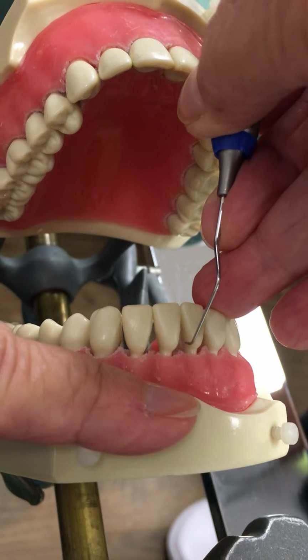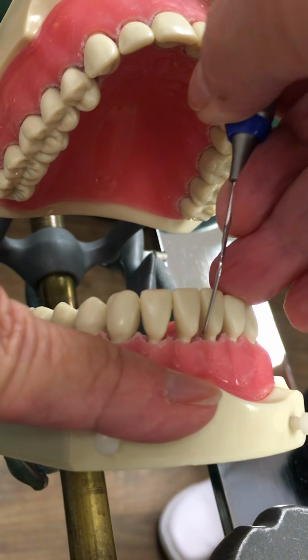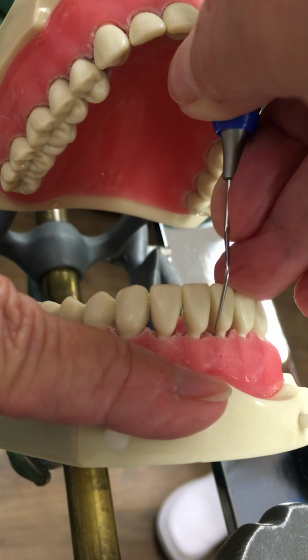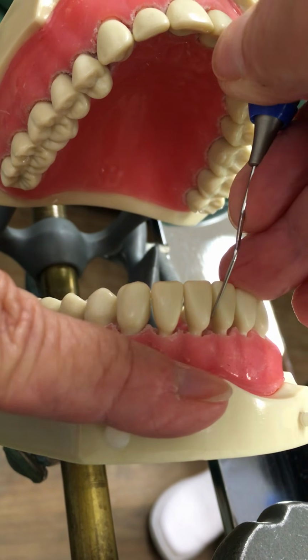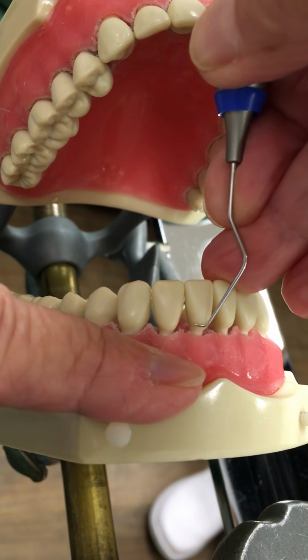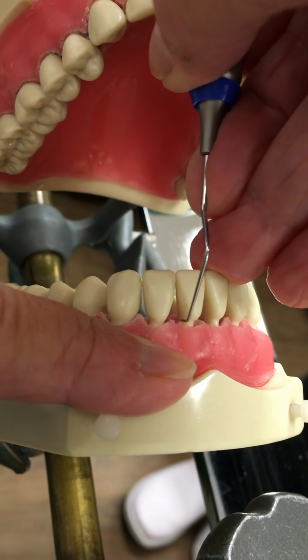And rolling each stroke, that toe toward the tooth, and the heel is off of the tooth. So as you go across the proximal surface, you're going to go up to the contact and back down as you walk across that proximal surface to the other side. Pick your fulcrum up, adjust your grasp, and move to the next tooth.